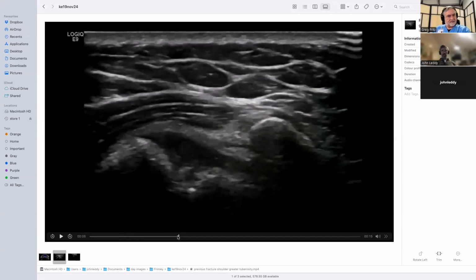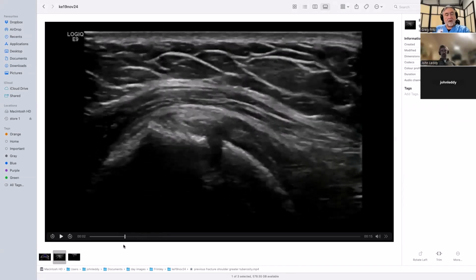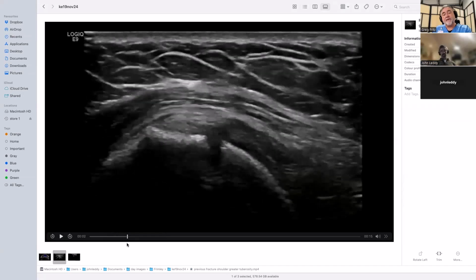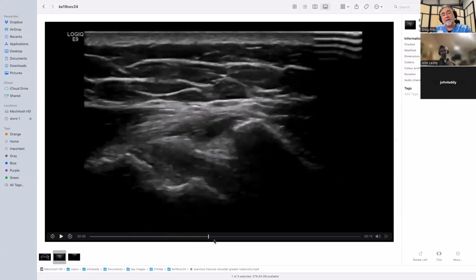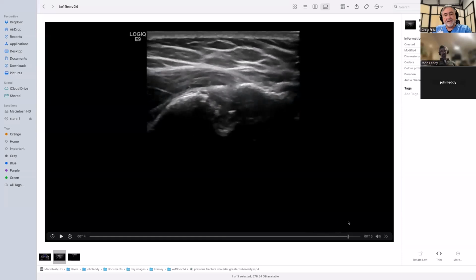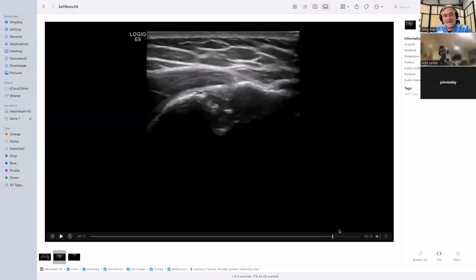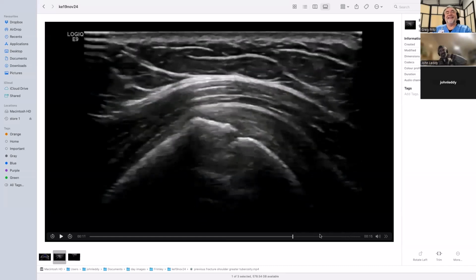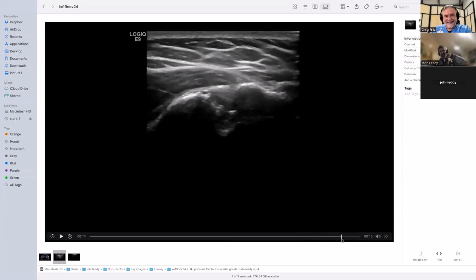So this is the last one, I think, where this is a previous rotator cuff repair. No, greater tuberosity fracture. Sure enough. That's a good one. And I was saying that's me looking at what happens, because they're complaining they can't abduct the arm. And I'm saying, yeah, I can see, I think this previous fracture is what is causing the problem.